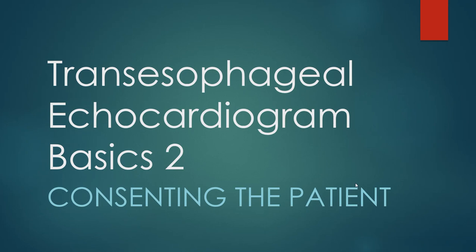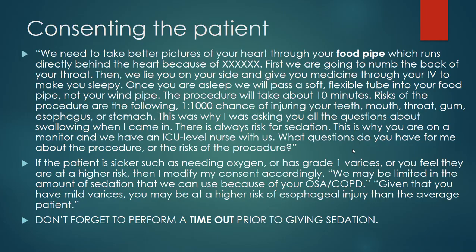Transesophageal echocardiogram basics part 2. This involves consenting the patient. Please refer to basics part 1 for indications and contraindications of TEE.